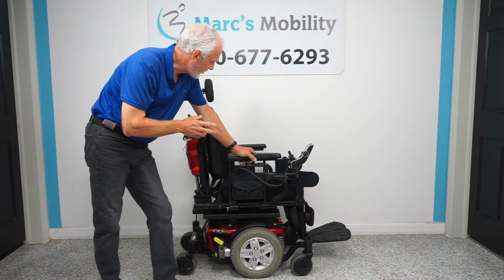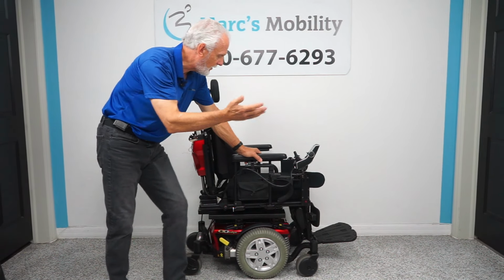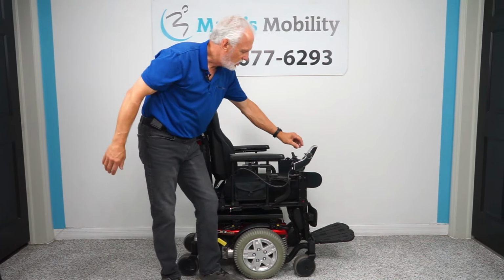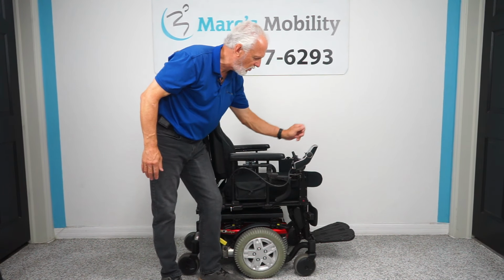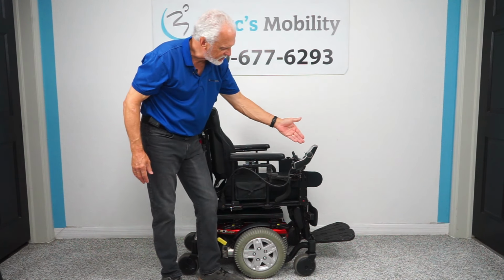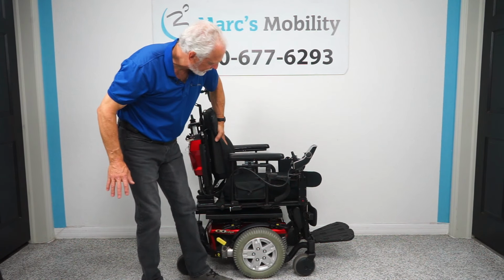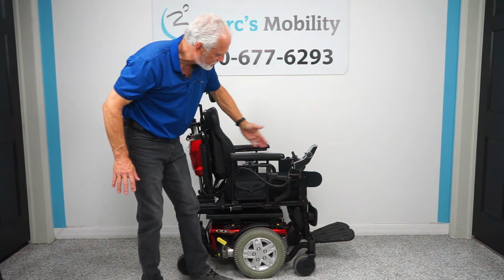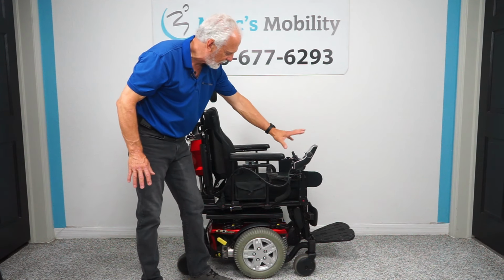But the first thing I'm going to show you, if you want to make the seat tilt, recline, or the legs go up, you need to go through the joystick and you would touch the button on the left side. The one you turn the power on, you're going to keep going forward until you see a picture of your seat. Now, as soon as you see a picture of the seat, if you want the tilt, you're going to want the bottom cushion, the back cushion to be orange. If they're not both orange, move the joystick sideways and change the colors on the seat. So right now they're both orange.